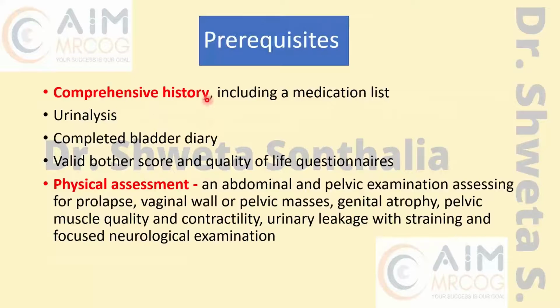Now, what are the prerequisites? Very important to understand what the prerequisites are. You have to tell the woman about the test. You have to inform her about what urodynamics is and why you are doing it. You have to take her history, including her medication list.